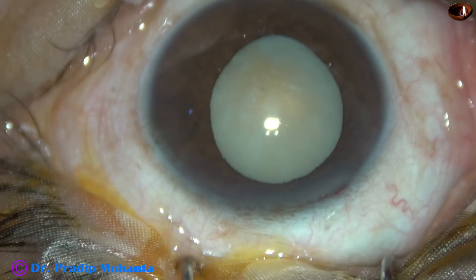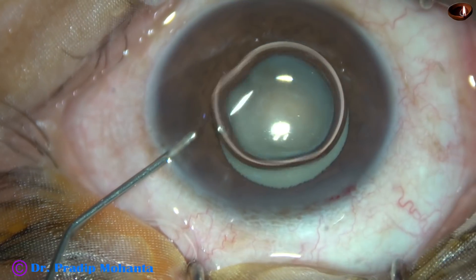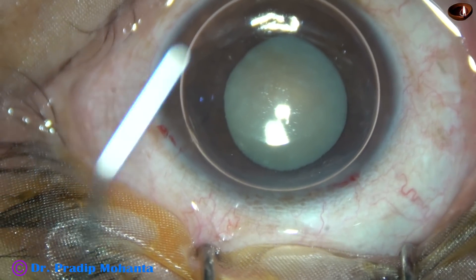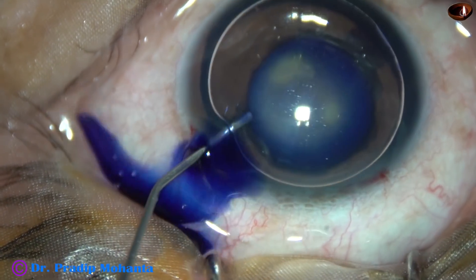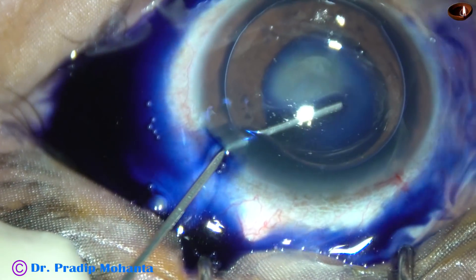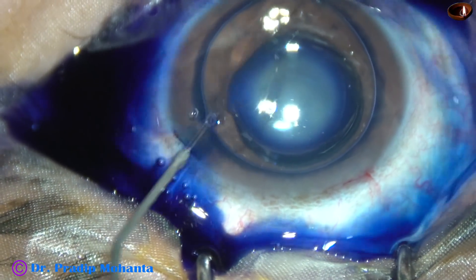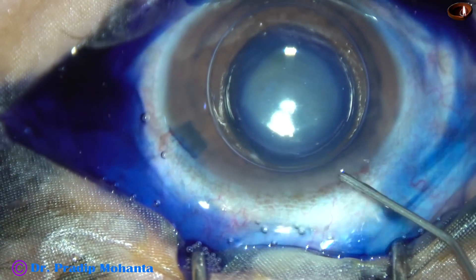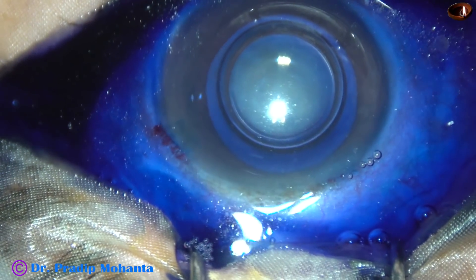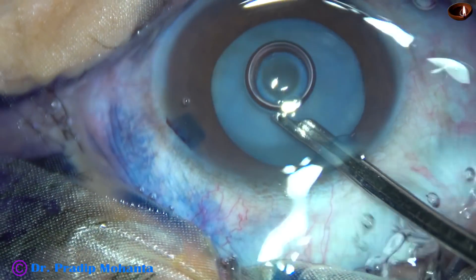By this time, the main incision has been made and a side port has been made on the left side of the main incision. Now, I am going to stain the anterior capsule of this cataract with trypan blue dye. Here goes the dye. And now, I am going to apply a bit of adrenalin — preservative-free epinephrine — to see if the pupil dilates a little more. Here goes the adrenalin. And see what happens — the pupil dilated very well with the adrenalin.